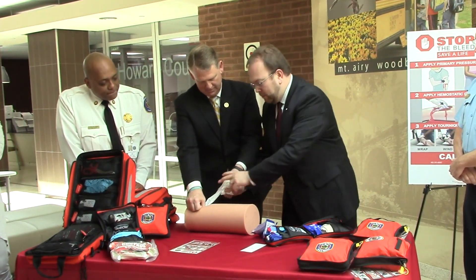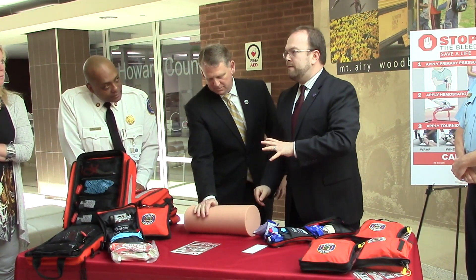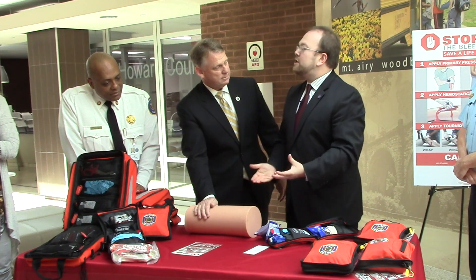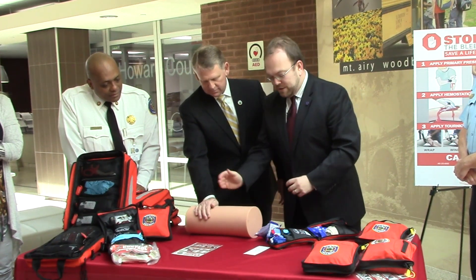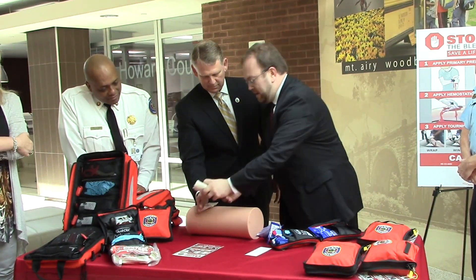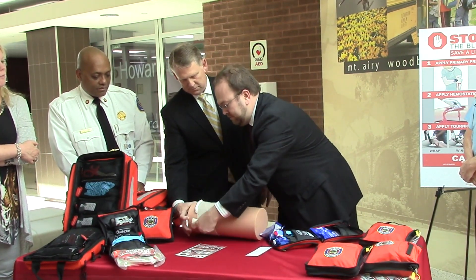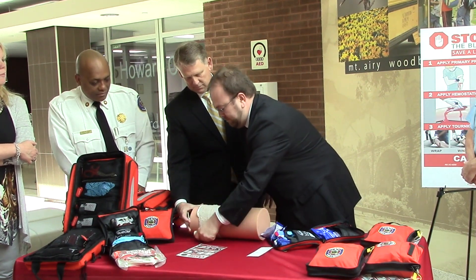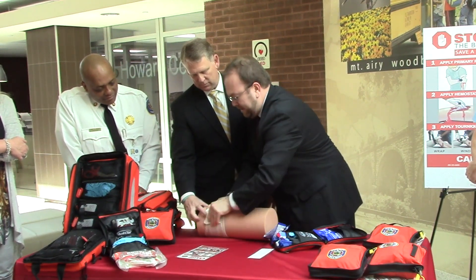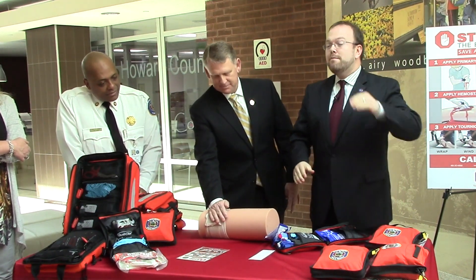We're going to keep going until it's full, and once it's all full in there, we're then going to put the rest on top and continue to hold pressure, because it doesn't work by itself. This is all about maintaining pressure — if the pressure we can maintain is greater than the pressure of the blood coming out, we're going to shut off the leaking vessel. We can then wrap that area with a pressure dressing, wrap it around just like an ACE wrap, nice and tight, while we maintain our pressure, and hold it in place with the Velcro adhesive.